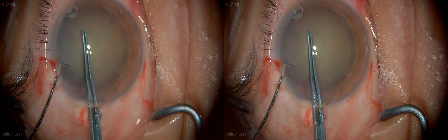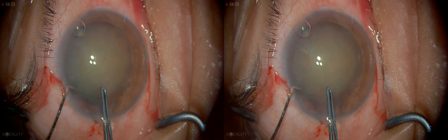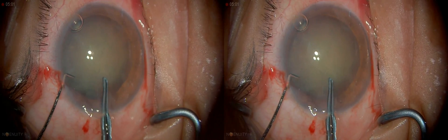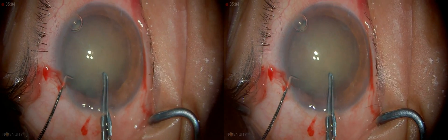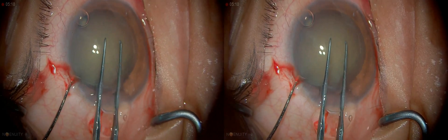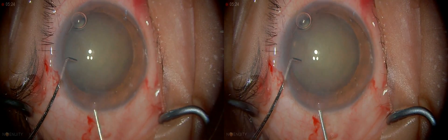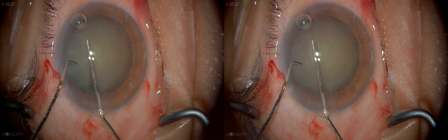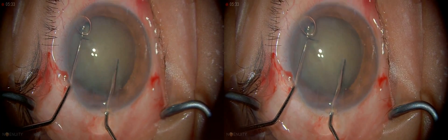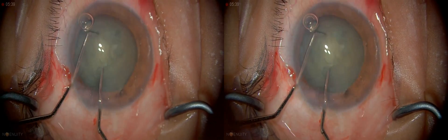Having the second instrument in enables me to control the position of the eye. I've initiated the rhexis and I'm going to go round slowly trying to get a nice round rhexis. That's the completion of the rhexis. And this is the hydrodissection. This is sort of the outside limit of where I would be able to do the rhexis without staining because there is really no good red reflex.